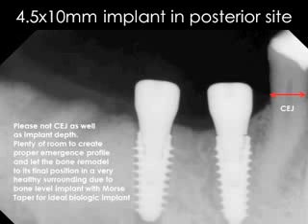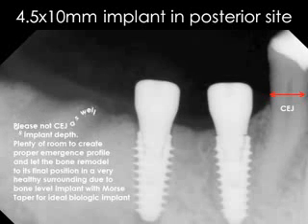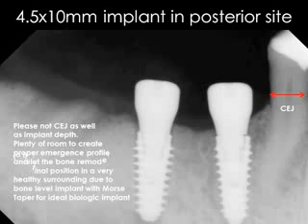Here you can clearly see your platforms at a nice even parallelism, typically 2 to 3 millimeters below your CEJ, your adjacent teeth CEJ. This one's a little bit deeper, again, because of that sloping bone, but we couldn't have one implant at one platform length and then other implant at other platform length. So we definitely placed our implants really nicely.